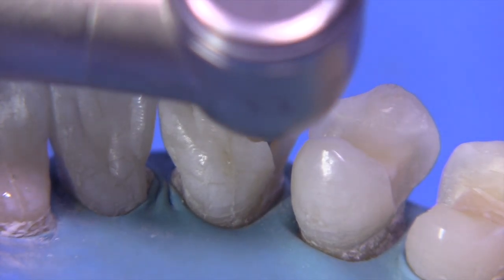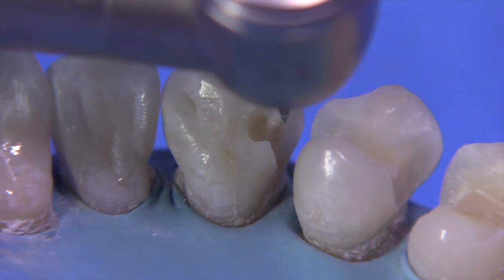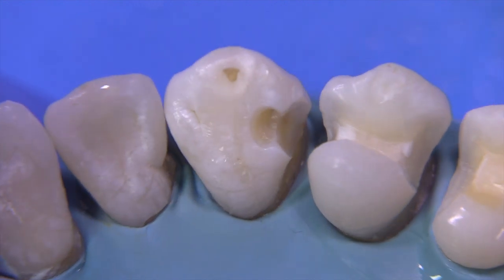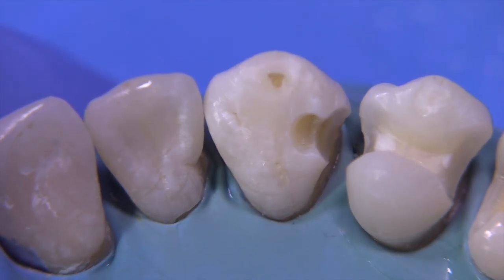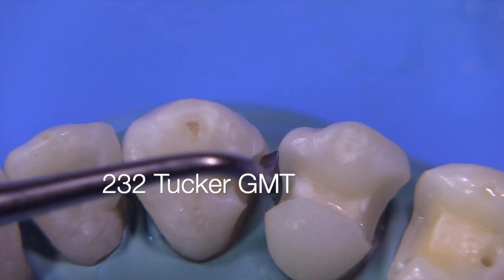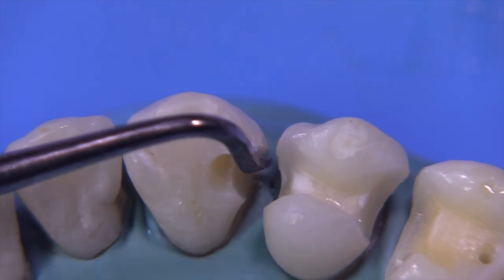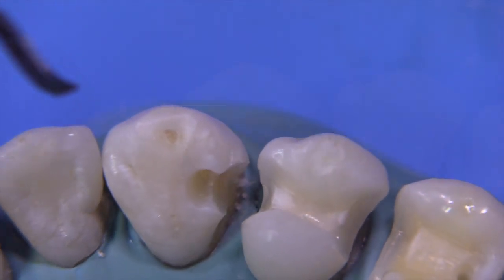The bottom half of this burr pretty much creates the draw. There — that's a little smoother, a little bit more draw. And if you have any undermined enamel, you can use the 232 Tucker, which is used for the distal, and you can just knock off any loose enamel. You can see it just easily carving away there, kind of in a reverse motion. It knocks it off pretty easily.